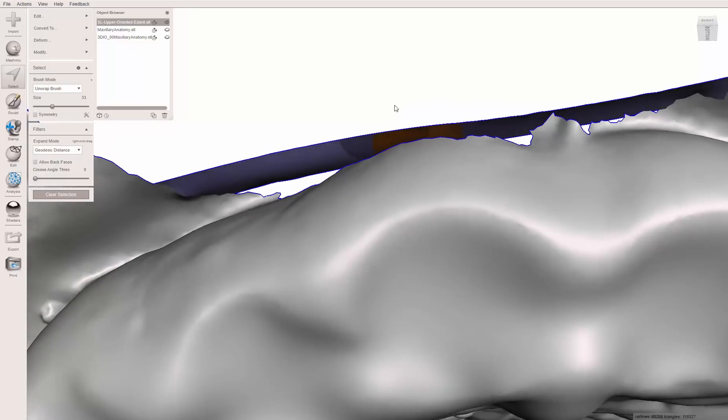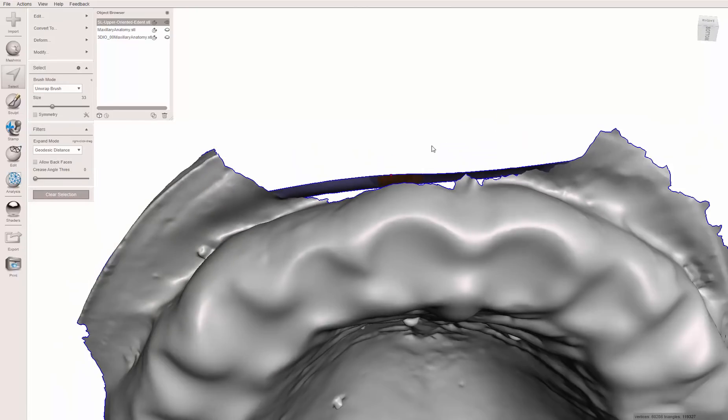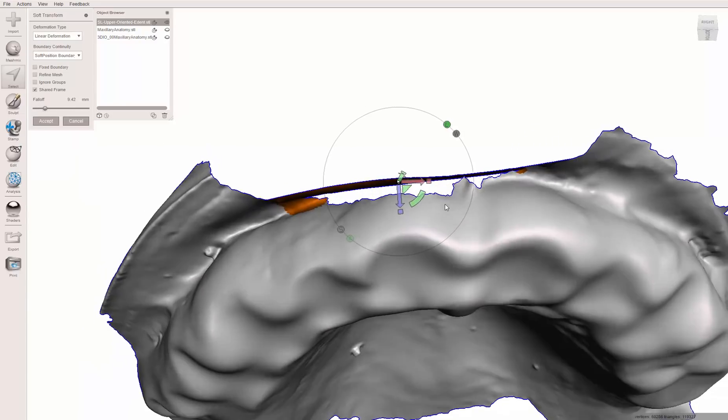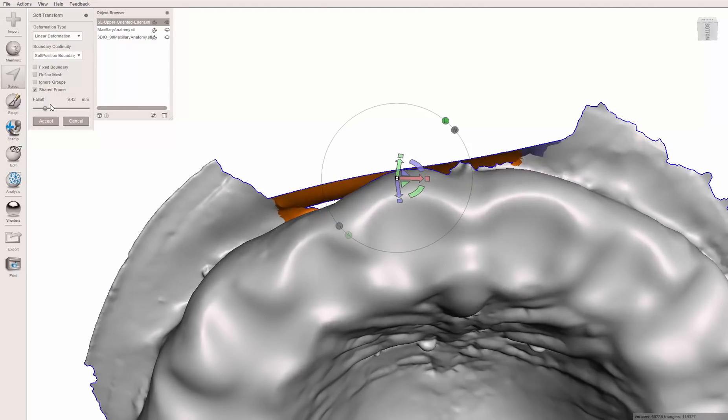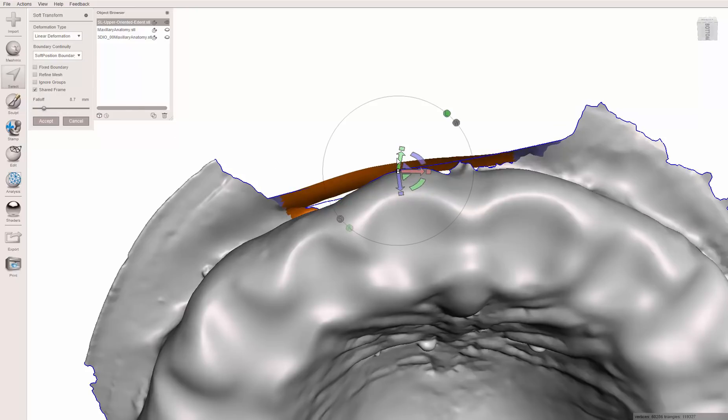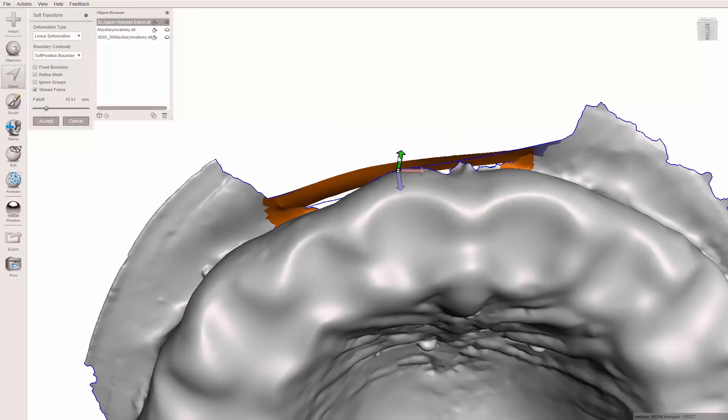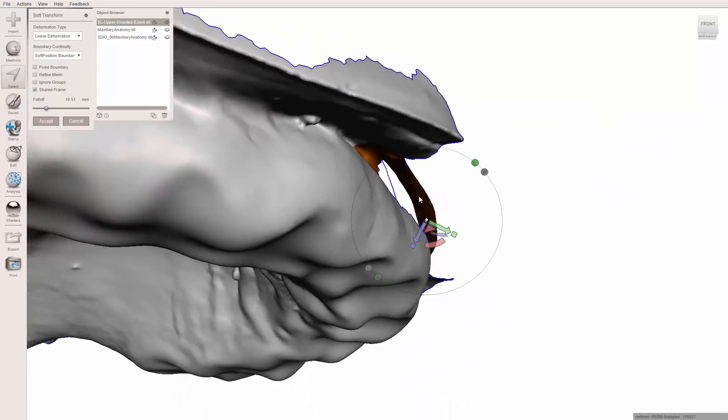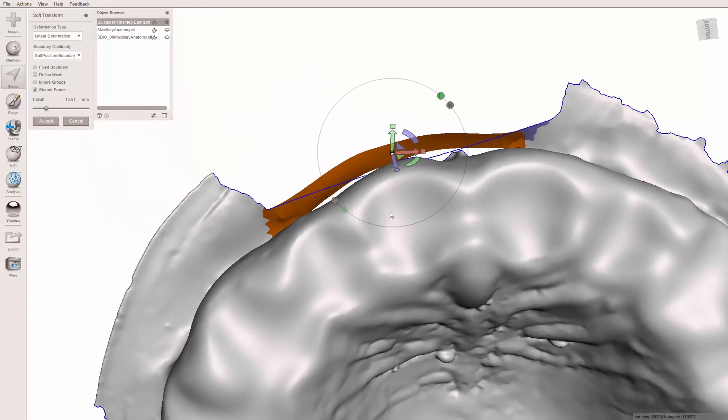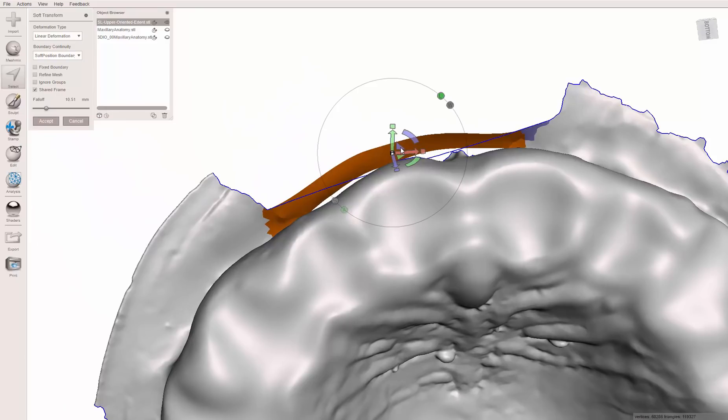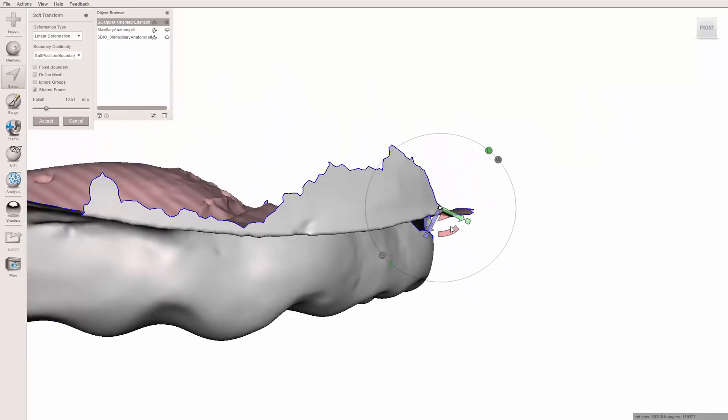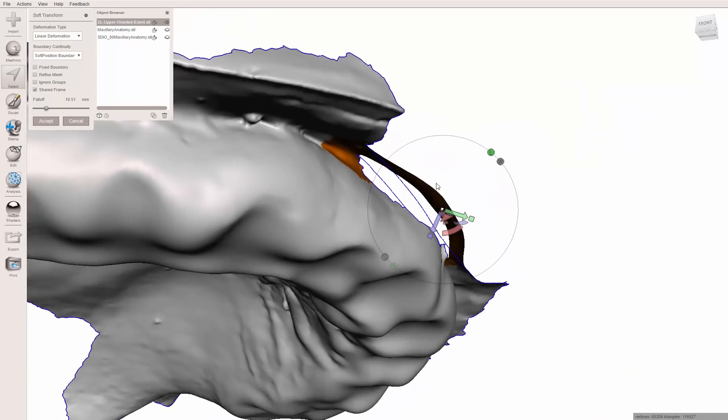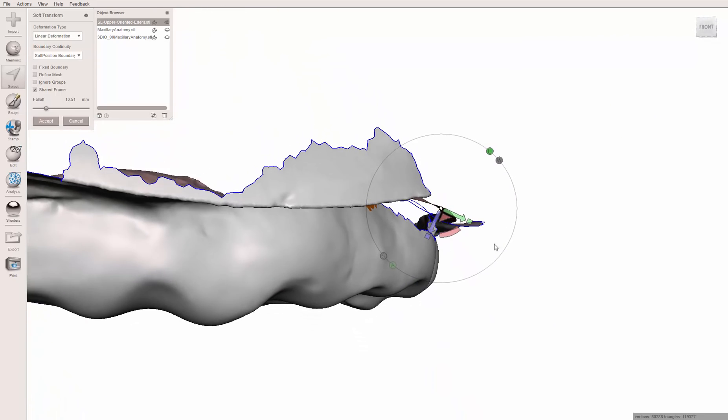What I'm going to do instead is I want the falloff area, which is how far the rounded part goes. I want it to be the entire length of this bridge. So I'm going to hit shift T. Here's the falloff. I'm going to drag it until it's slightly over extended. So now I can grab this and it kind of bends. In fact, control Z, I'm going to make it even wider. Try to get that effective area all the way onto the actual model. So I can stretch this out. And I can stretch it out in any directions I want.